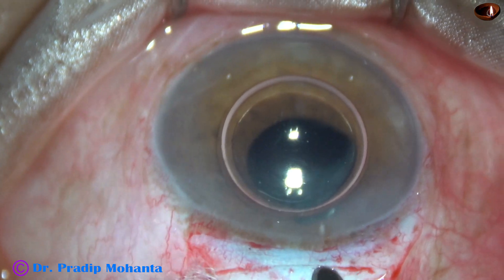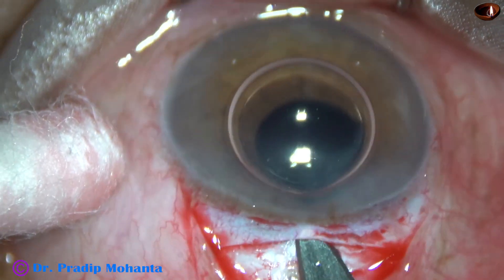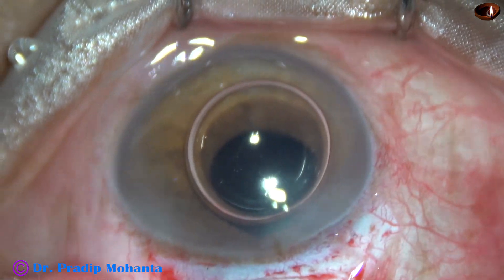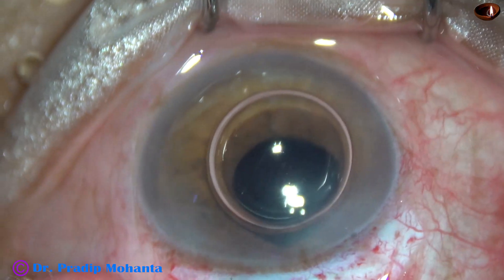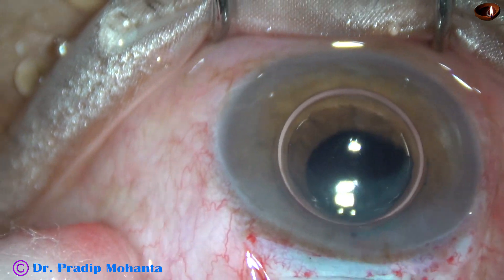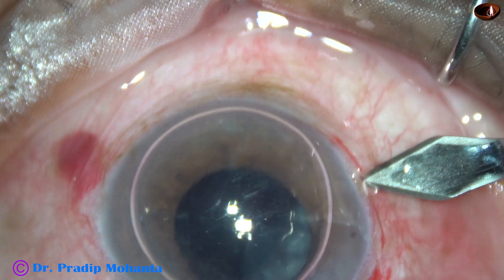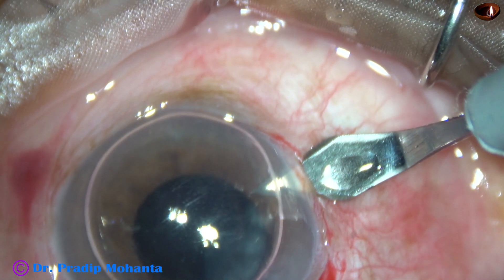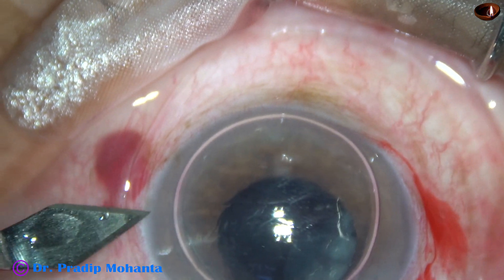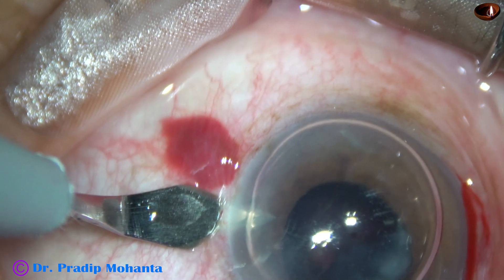Conjunctival peritomy and bipolar wet field cautery have been done. And now the sclerocorneal tunnel is being prepared with the help of this crescent blade. Since the iris claw lens is a rigid lens, we need an incision of about 6 mm. So a 6 mm sclerocorneal tunnel is being prepared, and this is for enclavation of the haptics. This is a side port at 9 o'clock, and this is a side port at 3 o'clock. These side ports are behind the limbus onto the sclera.